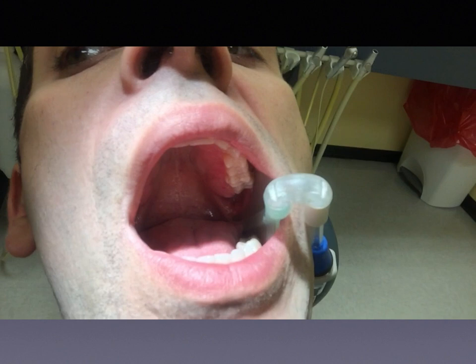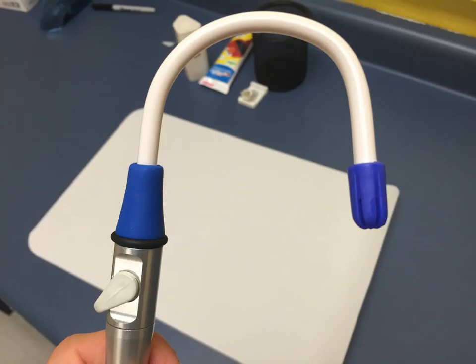In comparison, here's the Total Comfort saliva ejector. I personally feel this works much better, and price-wise it's a lot less. The ReLeaf costs about $1 per use, while this is only about $0.07. The way this saliva ejector is designed, it doesn't get much tissue suck at all — maybe a little bit every now and then, but overall it does a really good job.